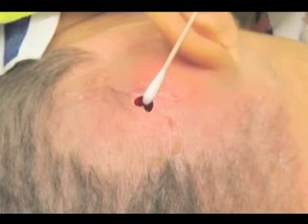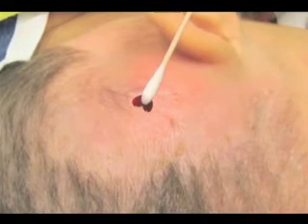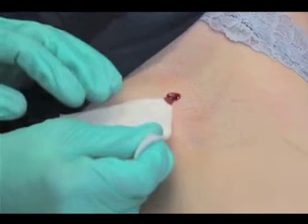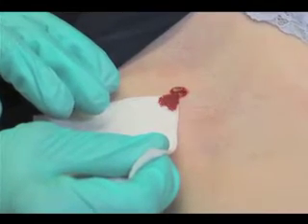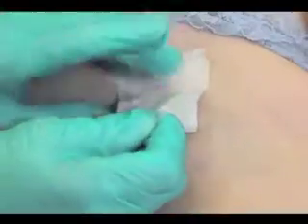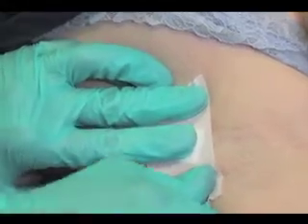On the scalp, bleeding may be brisk. The assistant can occlude the punch defect with a cotton tip applicator so the surgeon can visualize suture placement. Alternatively, place the corner of a gauze at the punch defect; the gauze will absorb the blood flow by capillary action, allowing for visualization for suture placement. In patients with thrombocytopenia or those taking an anticoagulant, it is typical to place a pressure dressing over the sutured site to prevent late-onset bleeding. It can be left on for 24 hours.